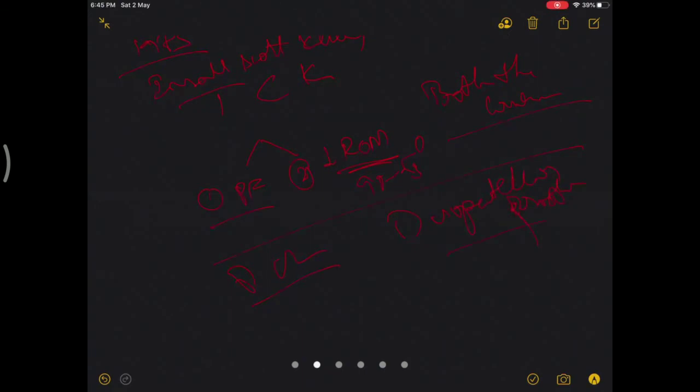They retained the PCL, and they had a slit in the tibia for the PCL and the same notch in the femur, and they used pegs for anchorage to the bone, and a button-like patella which resurfaced the patella.